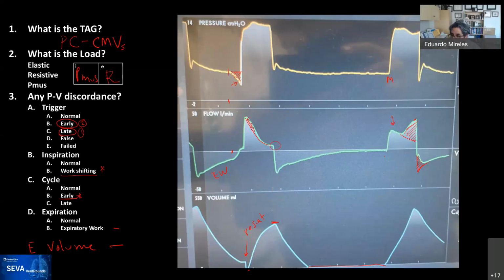What else? Questions from the team? Let me ask you a question, because this is a common one, and Ariel had brought this up the last time we did this in Spanish. So you come by and you have this patient, and you see this abnormality and it's occurring.